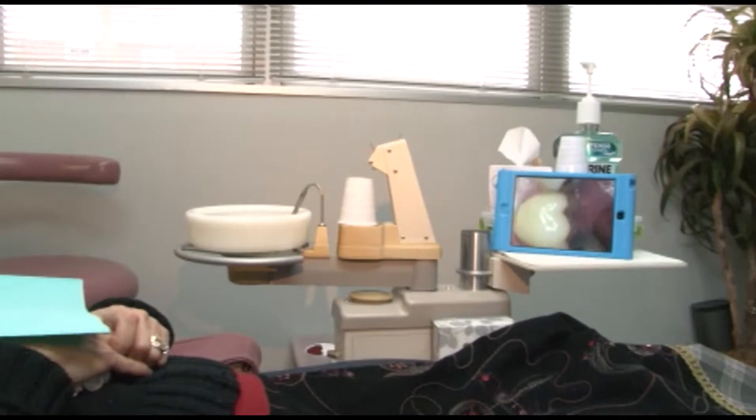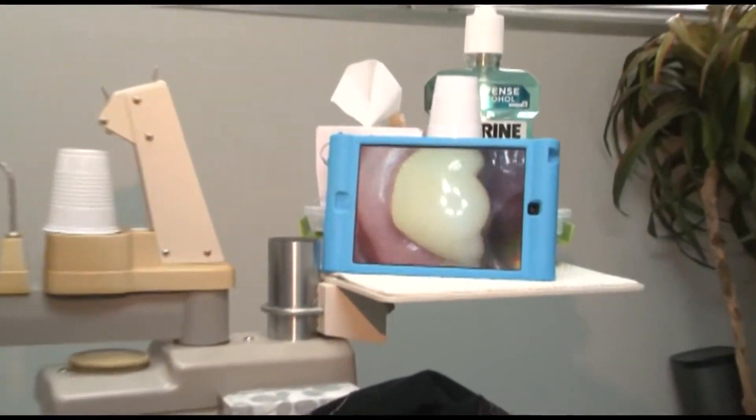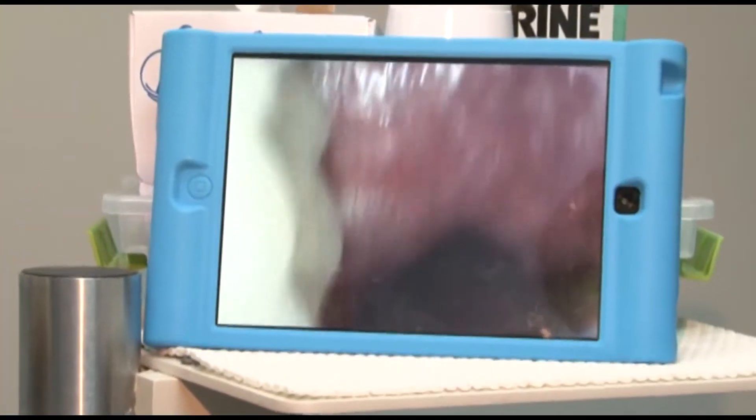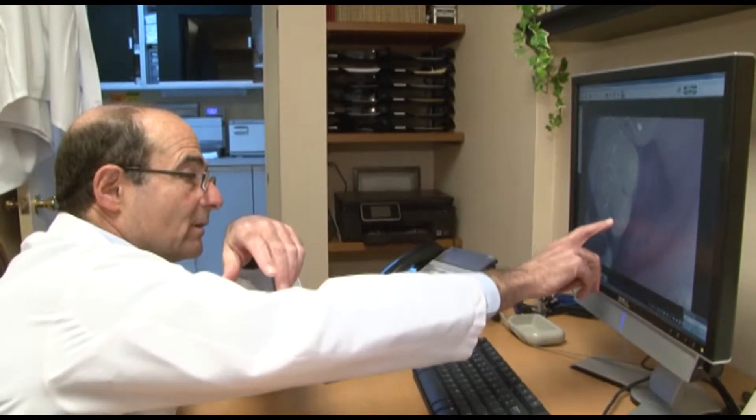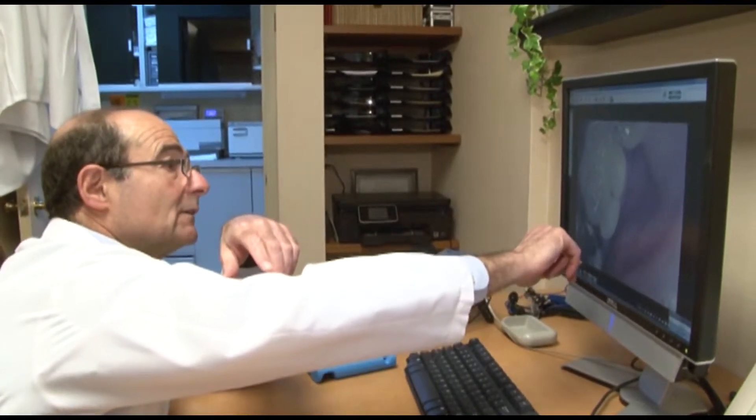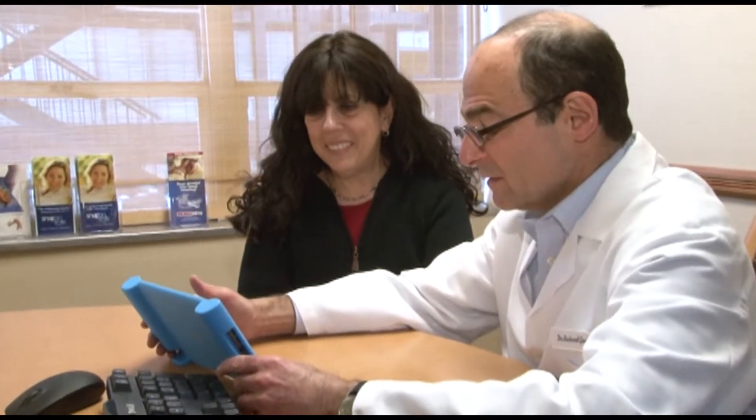Best of all, the Hamilton intraoral camera is Wi-Fi enabled and will seamlessly display and store images on your iPhone or iPad devices with the free app. You can also download images to your computer or tablet via the built-in USB port.